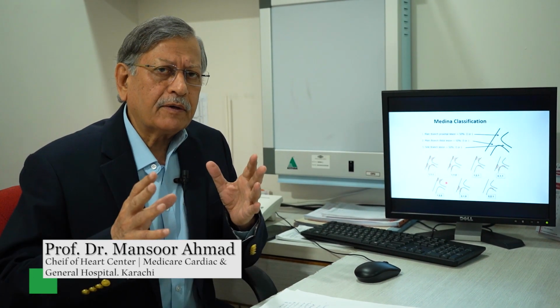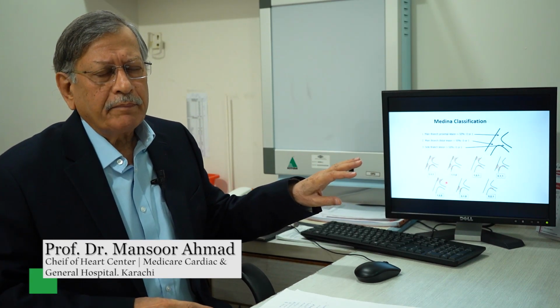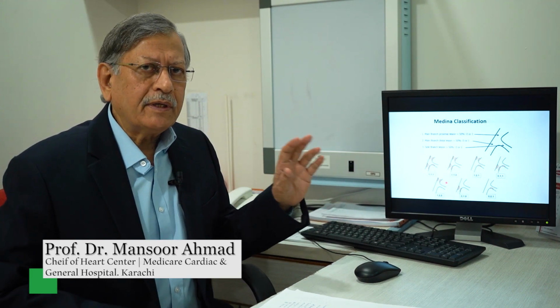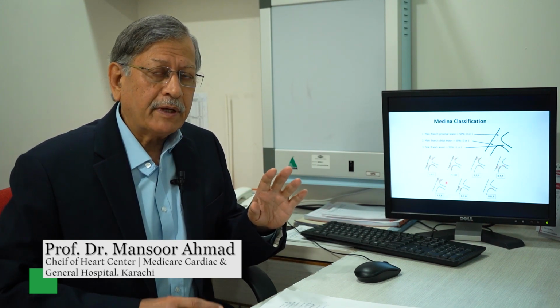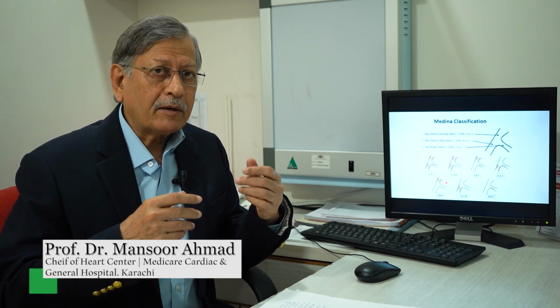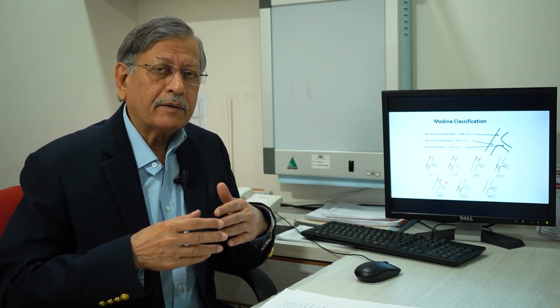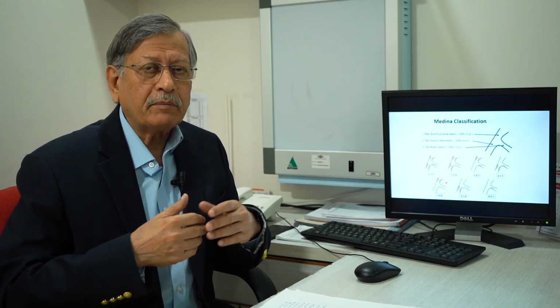Let us talk about all these morphology of the plaques that we have talked about. Now, whatever we have seen on angiography or through imaging, everything we see should be considered as dynamic. It's not fixed, because during the procedure, anything may change. While wiring, it may change. While ballooning, it may change. The plaque may shift into a side branch or may shift distally, or the calcium may not break, or calcium may go down and cause problems.